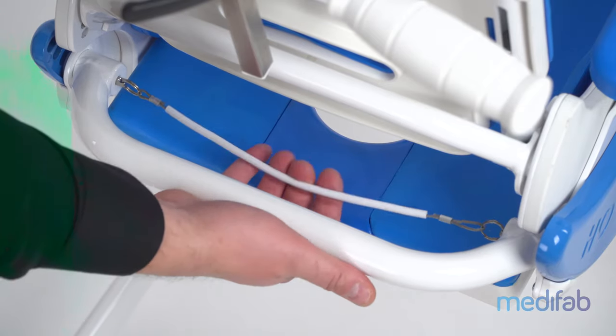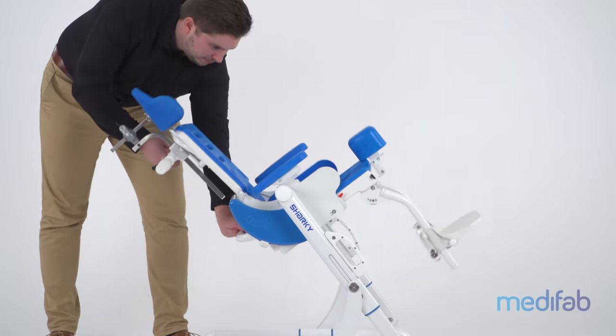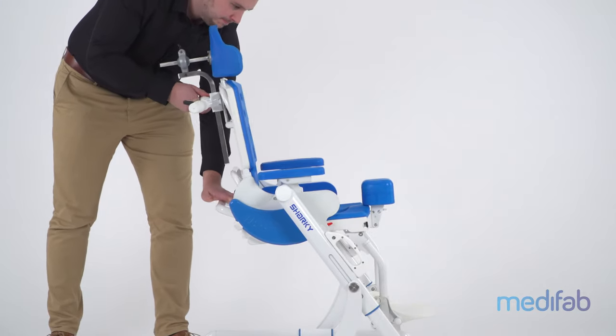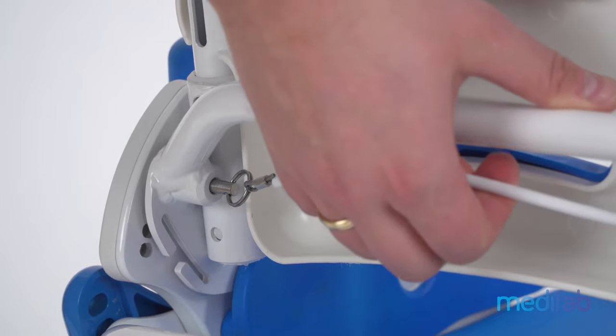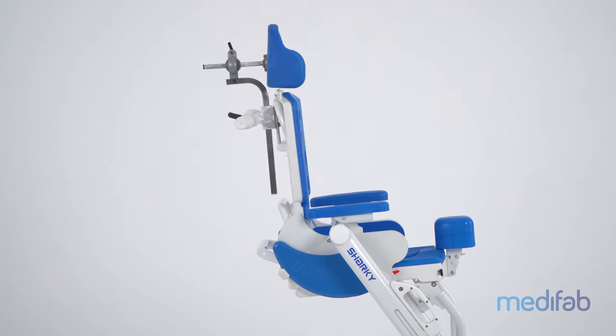Easy one-handed operation allows the seat tilt angle to be adjusted between 45 degrees and minus 10 degrees in 12 increments. The back can be reclined independent of the seat angle between 72 degrees and 120 degrees in 8 increments.